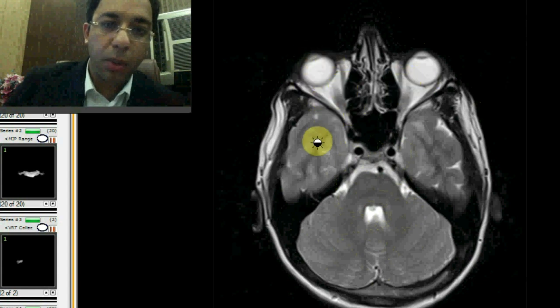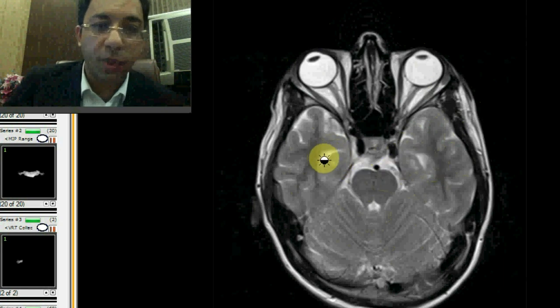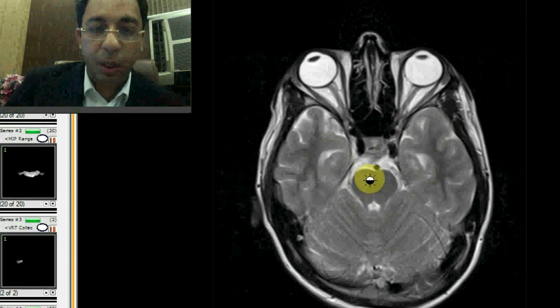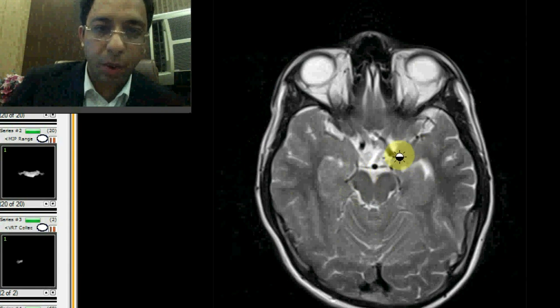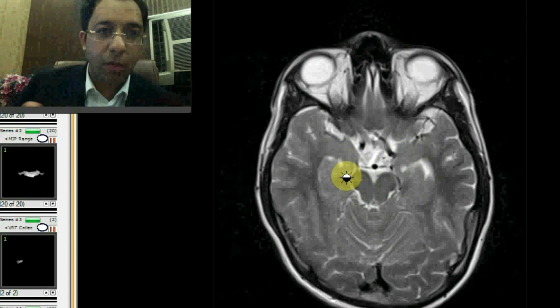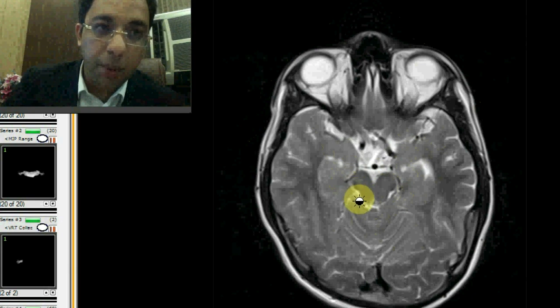You can see the globe and appreciate the extraocular muscles. You can see the temporal lobe now. As I go up, you can see the temporal horn — this white area is the temporal horn of the lateral ventricle. This is the beginning of the midbrain. You can see the interpeduncular fossa, the basilar artery, the cerebral peduncles, and the medial part of the temporal lobe, which is the uncus.